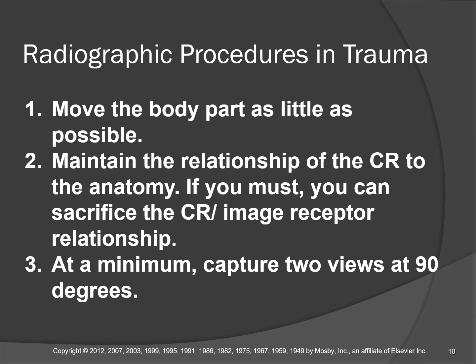You need a 45-degree transverse angle manifested with a pivot button. Okay? And then necessarily you can't shoot with a grid because you'll have grid cutoff. But you're maintaining the relationship of the central ray to the anatomy. You're not able to rotate the patient 45 degrees, so you have to rotate the tube and the beam 45 degrees.